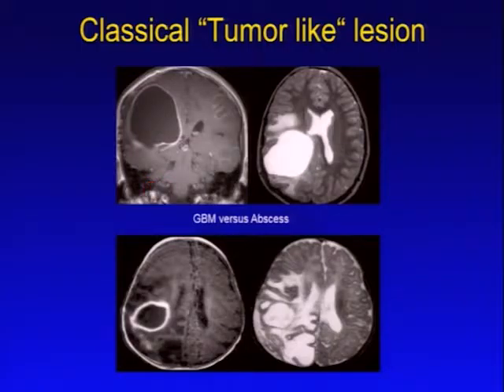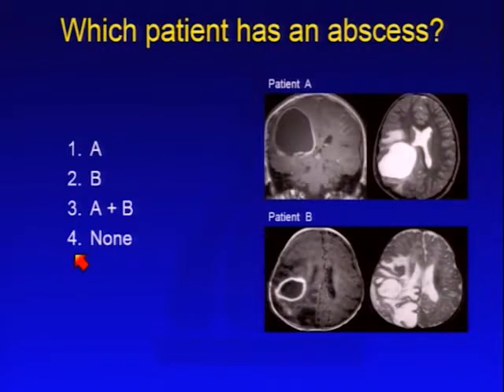And I'm unfortunately also somewhat longer in neuroradiology. That means that there was a time we didn't have diffusion-weighted imaging, and my teacher would say, oh, you can easily differentiate those 2 cystic lesions because you look at if there's a peripheral enhancement and the amount of edema, the primary location where you have more enhancement, how thick the rim of enhancement is, and then you can make an estimated guess of is this a GBM, or is an abscess the other way around? Now, if I ask you this, I force you to make an estimated guess, I suppose most of you will make the correct diagnosis. Which one is the abscess?